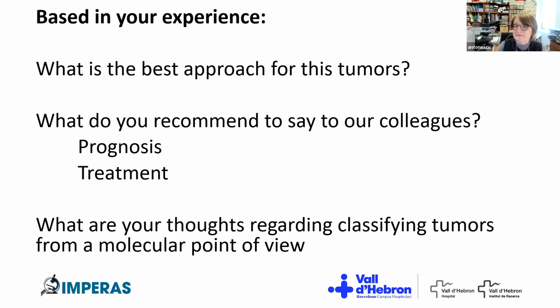So this is the first entity that we saw within the EWS CREB fusion that shared features from two different entities. Again, the jury is out there.